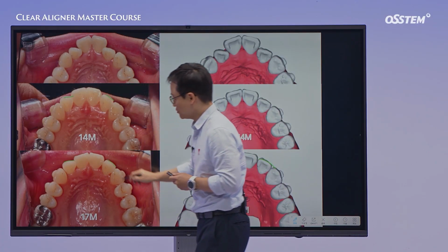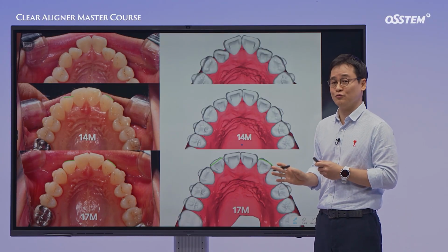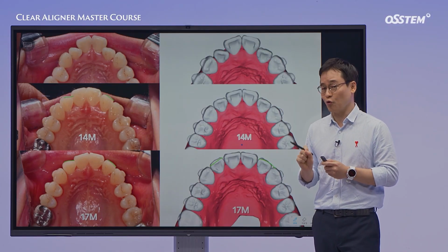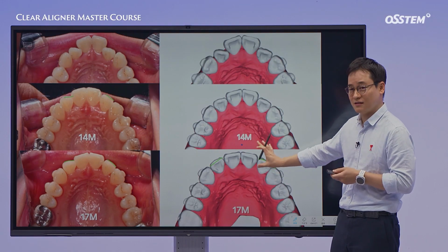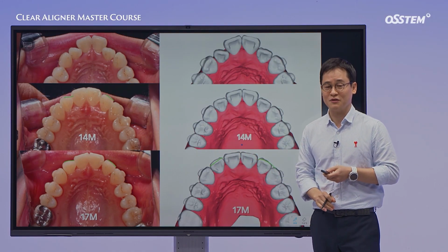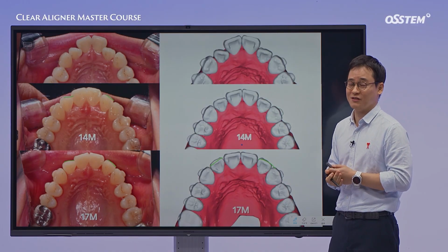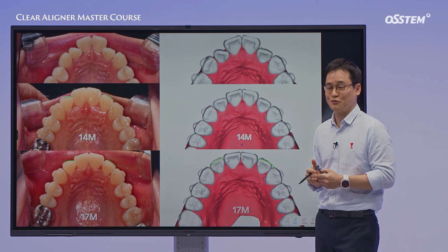The rotational correction wasn't ideal. And since the patient wore the aligners well, compliance wasn't the issue. So our clinical judgment becomes important. So the question is, how should we proceed from here? Some clinicians may blame the appliance. But before we jump to that conclusion, we should pause and think once more about why it didn't work.